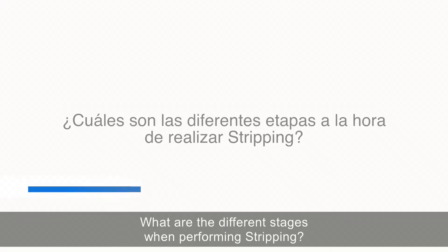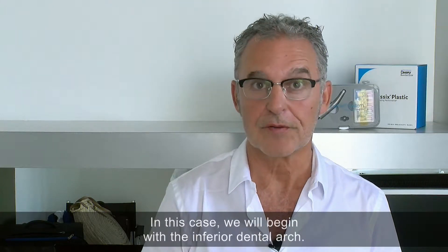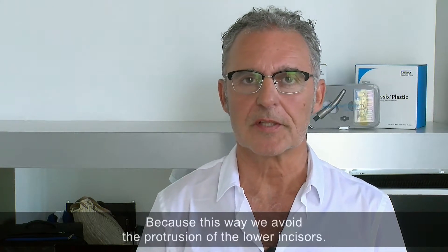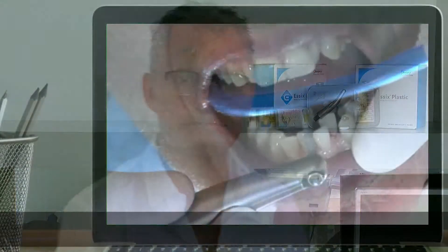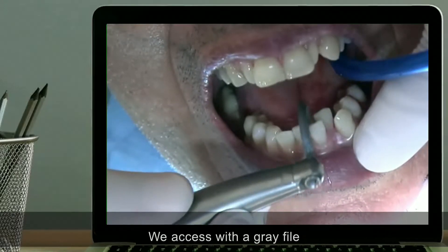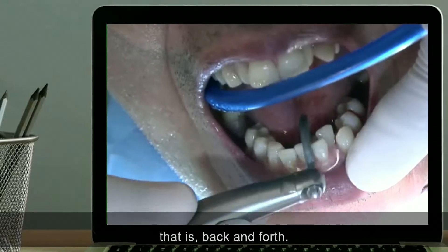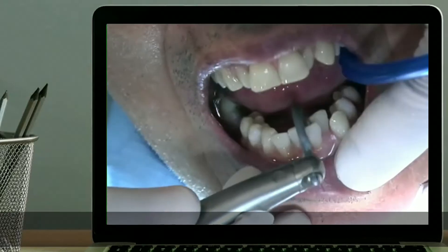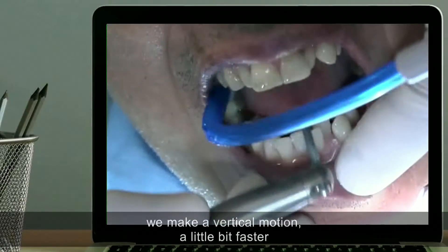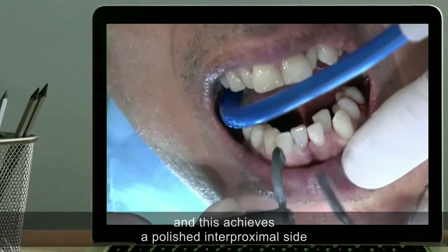What are the different stages when performing stripping? Each stripping case is different. In this case, we will begin with the inferior dental arch, because this way we avoid the protrusion of the lower incisors. We access with a grey file, which allows us easier access with a soaring motion that is back and forth. This facilitates the entry for the file. And once we are in, we make a vertical motion a little bit faster, and this achieves a polished interproximal side, shaped like we want.